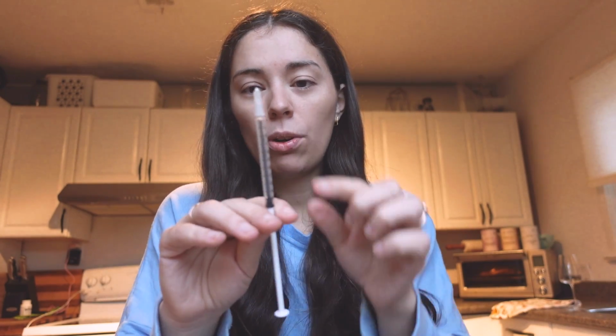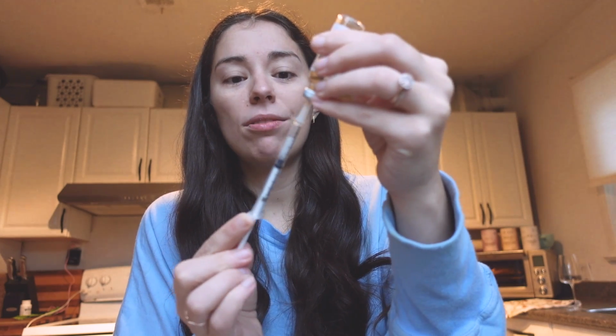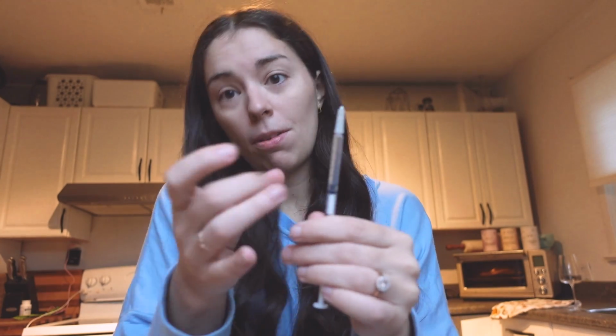So I actually like to put more air into the bottle. So fill up your syringe with air and then pop it into the bottle. Boop. And then you fill it up with the air. And that makes a pressure change in the bottle so that the medication comes out a lot easier. I'm sure you won't be able to actually see any of this. There we go. And then I like to fill it up extra and then back it up to where I need. And then I'm just going to flick out all my bubbles. This is just like a needle walkthrough today.